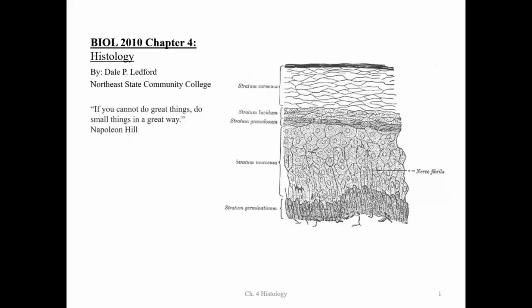I'm in a classroom, but I wanted to use a classroom that has a touch screen so I can draw on the tissue slides and let you know what the things are. So this is the histology section. In lecture, we talk about histology and what it means. So we did talk about that.